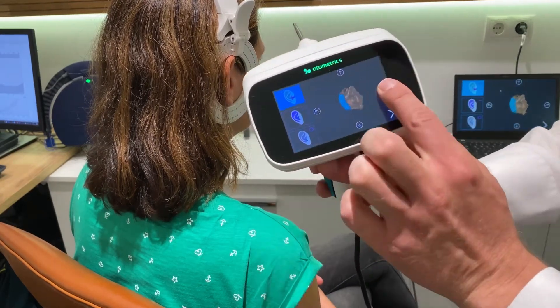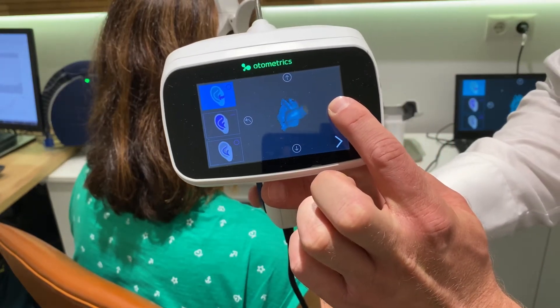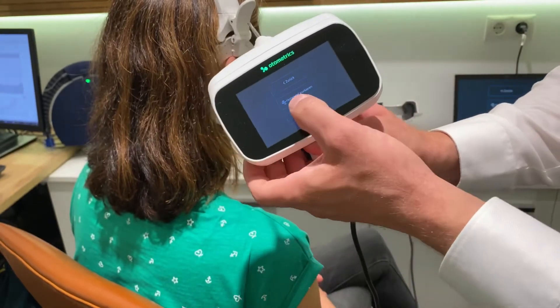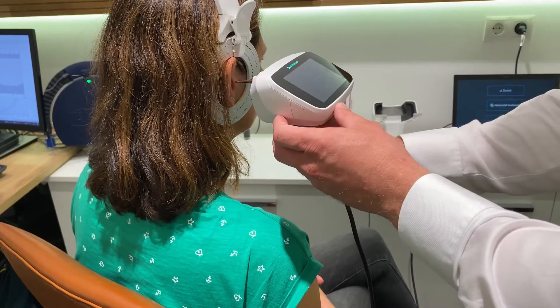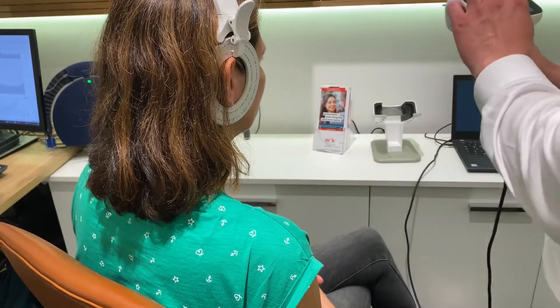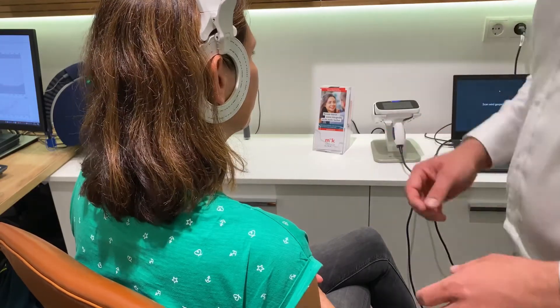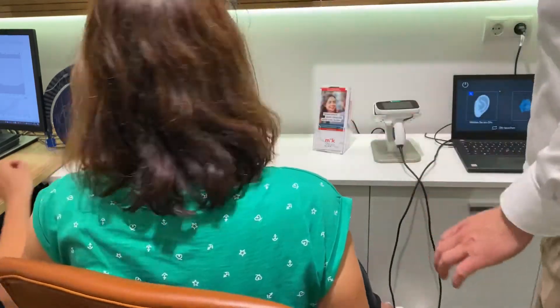OK, then I'm going to double check whether everything is where it should be. I'm quite happy with the result. This is one horizontal measurement and we are ready to go. The data is now sent into the cloud, the Otoscan cloud.